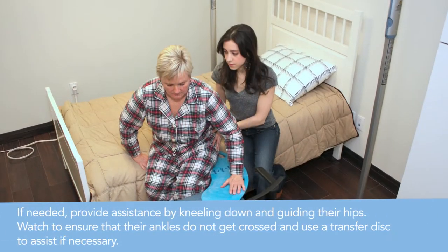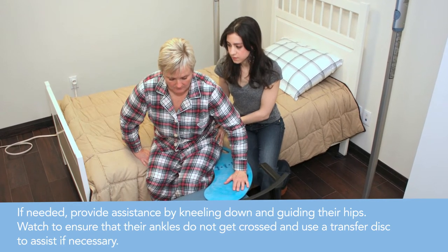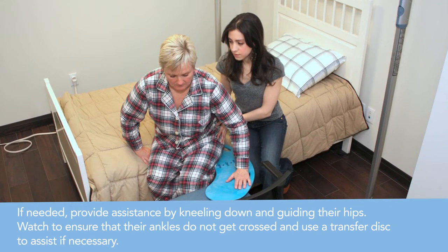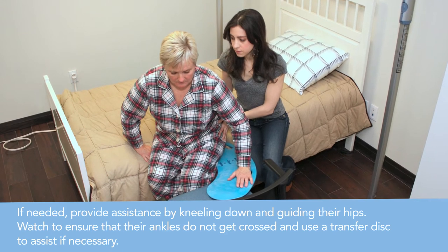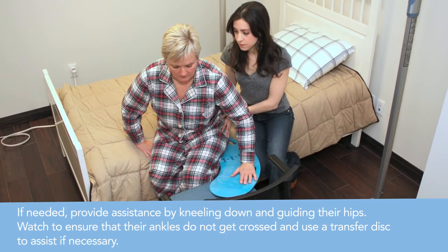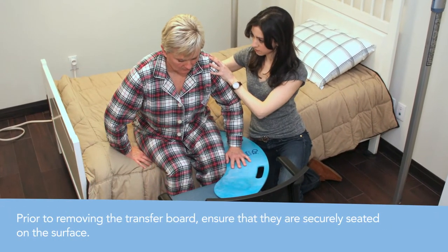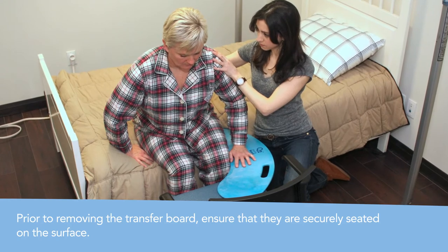If needed, the caregiver should provide assistance by kneeling down and guiding the person's hips. The caregiver should additionally ensure that the person's ankles do not get crossed. If necessary, use a transfer disc to further assist. Ensure that the person is securely seated on the surface prior to removing the transfer board.